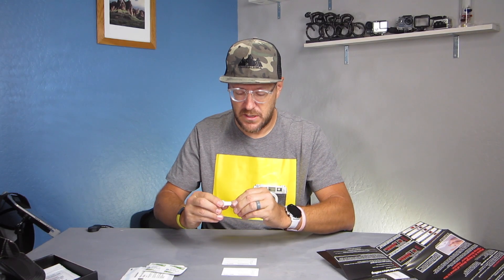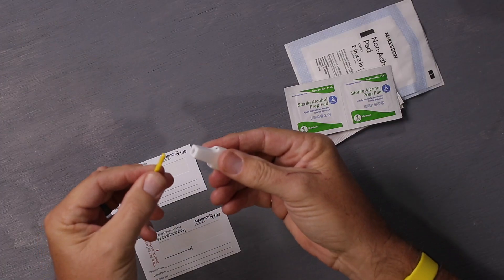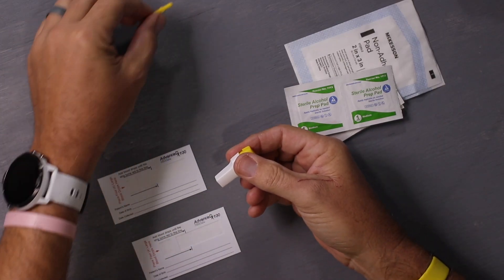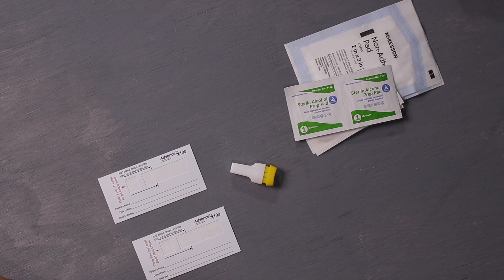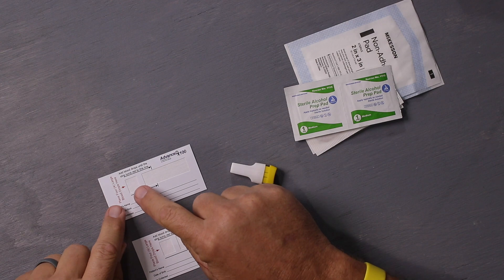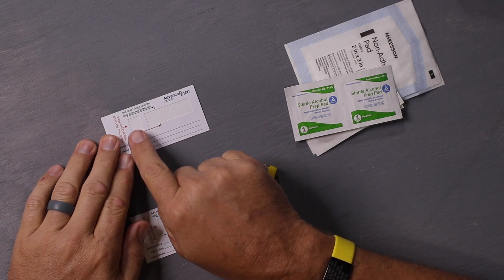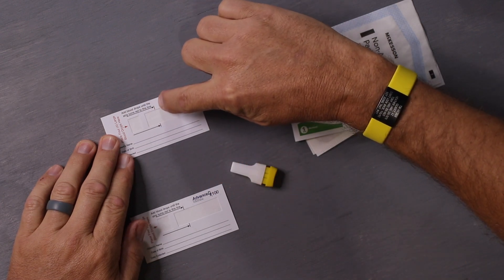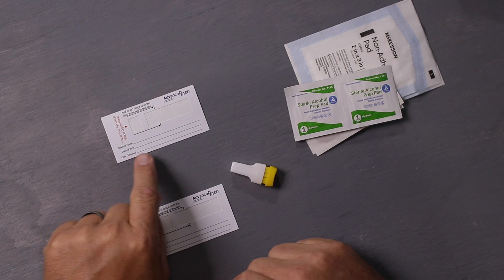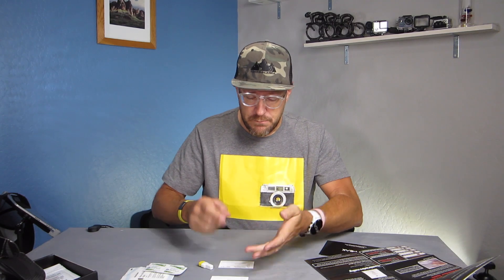Here are the lancets — they give you a couple of different ones. I just removed the cap and when I press this down it's going to send a little needle out. When collecting the sample, you want to make sure you're collecting it in this little box on the card, and it's going to drip and flow under this piece here. You want to keep adding blood until this line gets filled. When you're done, fill out your name, birthday, date collected, and all that. I'm going to poke my finger on the inside of my ring finger.